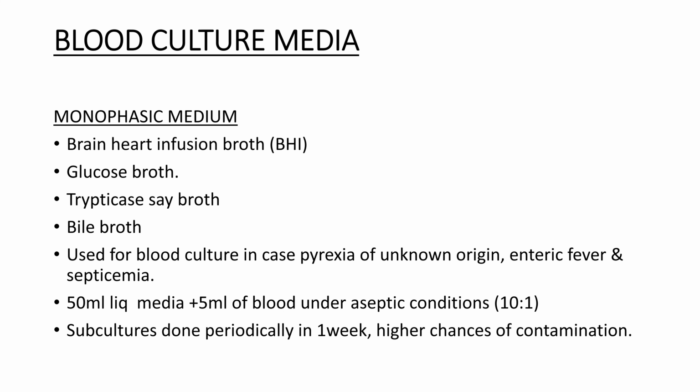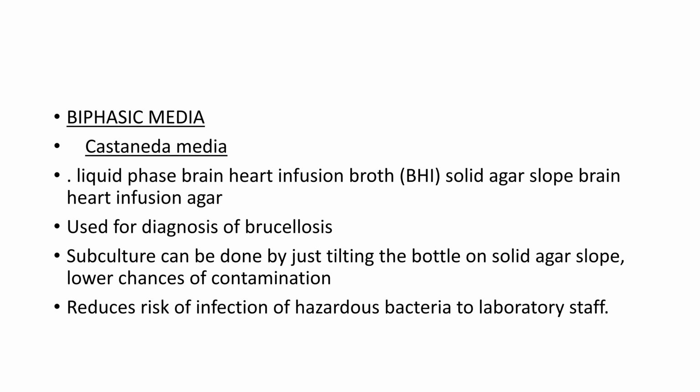So what is the basic media present in it? It is 50 ml of this broth plus 5 ml of the blood, taken under aseptic conditions, that is a 10:1 ratio, right? Subcultures are done periodically, after 1 week, and there are higher chances of contamination.